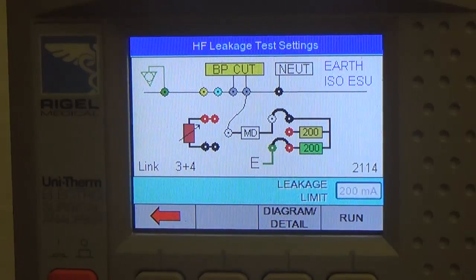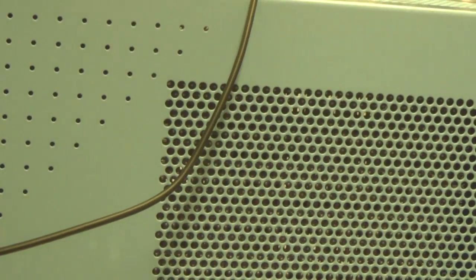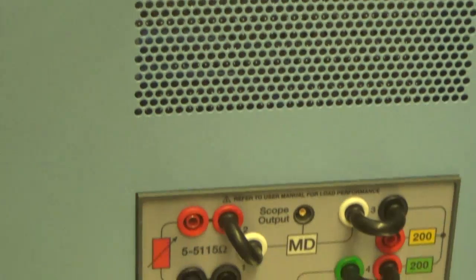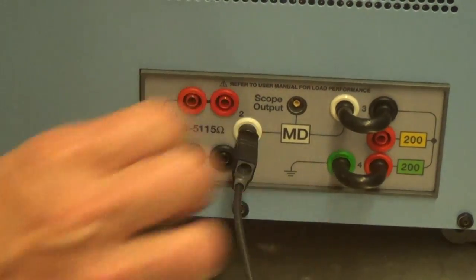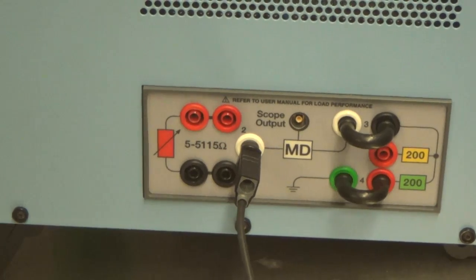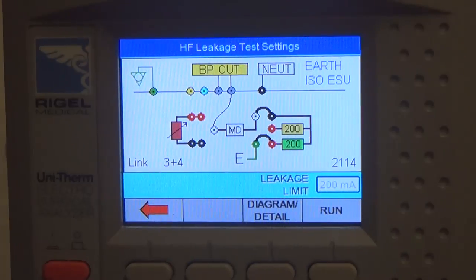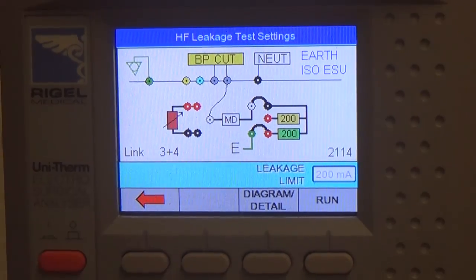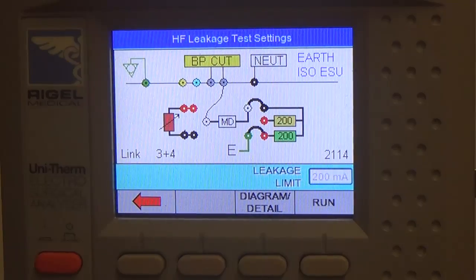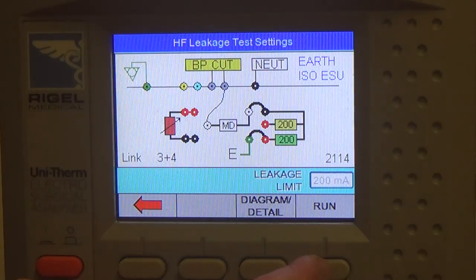And now, look at this. So again, we're using the right tine, which is the black cable, very similar to the other test we did. So this red one is disconnected. This jumper's out. We're testing the right tine. So we're simulating a failure, an open of the left tine, by doing this. Notice that the left tine is open. So that's what they want you to do. All of these checks are trying to measure the worst case under some failure condition, just like when you perform an electrical safety test and you open the ground.